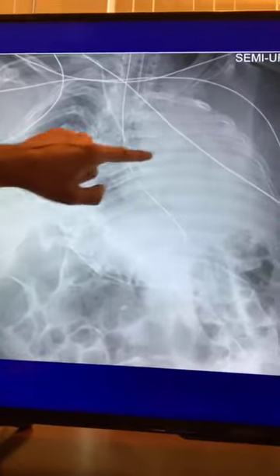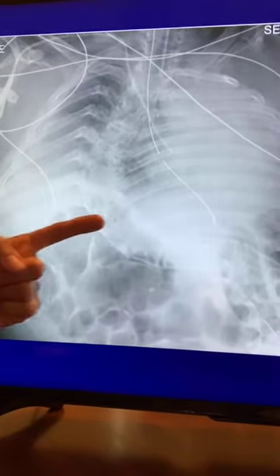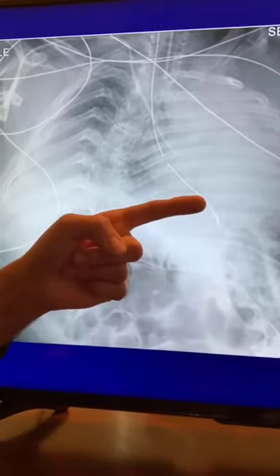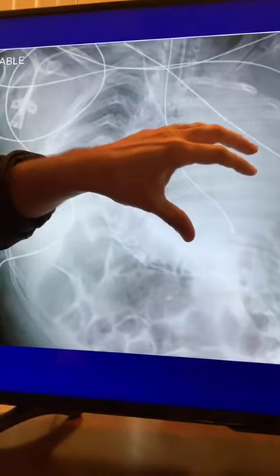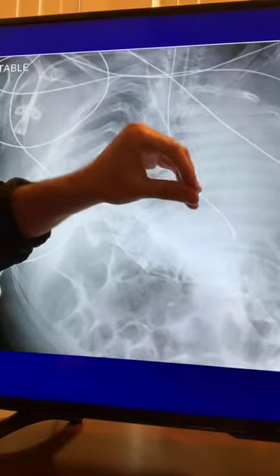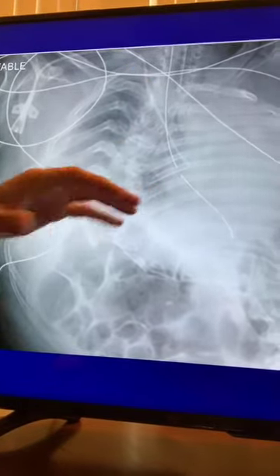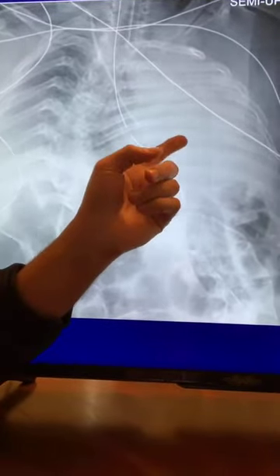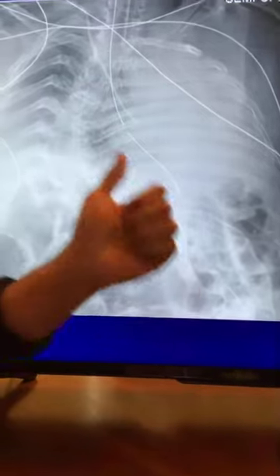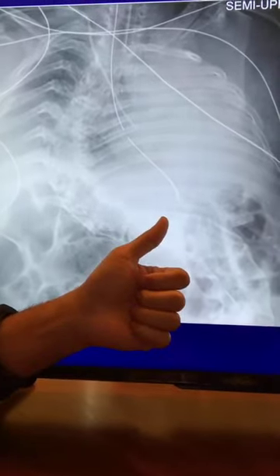So this is all heart, right? And because the heart is shoved that way, because the heart is in a weird location all the way over there, that portion of the lung is probably really atelectatic, meaning it's really scrunched down, it's collapsed, all right? So now you're thinking, all right, this whole whiteout of the lung over here, or this hemithoracic whiteout, is largely due to the heart being pushed over, all right? And there's a lot of atelectasis.